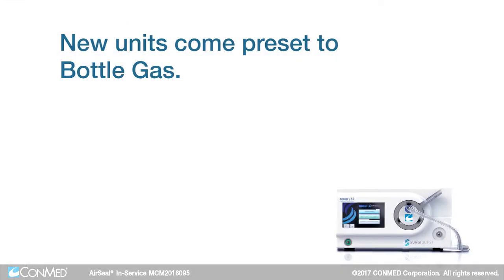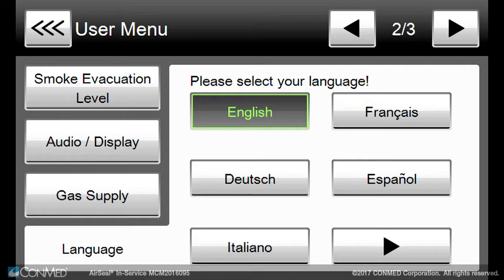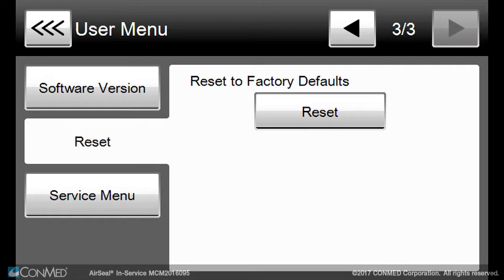New units come preset to bottle gas. You may choose from 14 languages, and you may reset all values to the factory defaults.